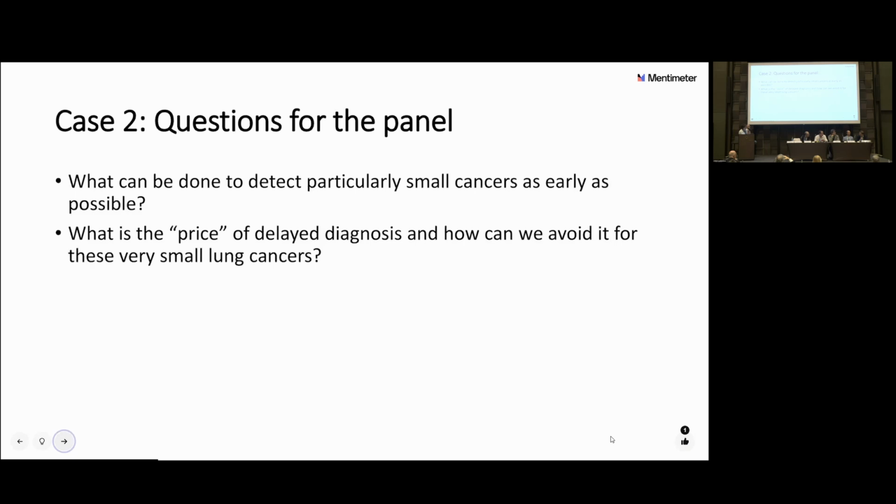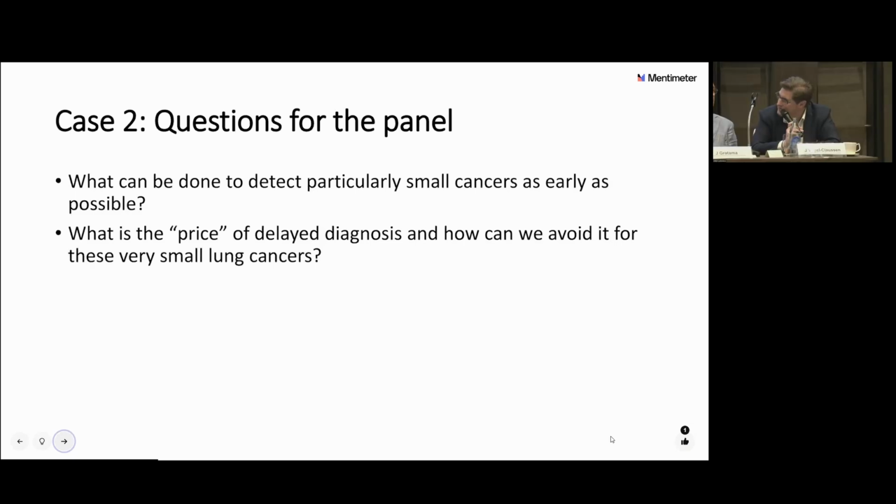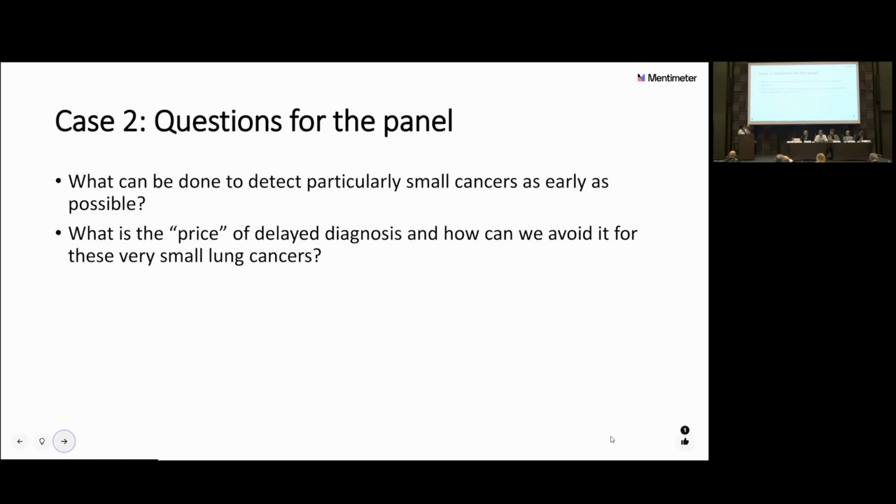Yes, please. Yeah, in the Hansa study, we go one step further. We don't report any nodules in the report, only if they're positive nodules, which are sent to MDT, we report. Other than that, we just say it's intermediate. There is a nodule, we call them, right? Explain the finding, but in the report, the nodule size is not mentioned. And in the negative cases, nodule sizes are not mentioned as well. So in this case, you would not have mentioned it at all.